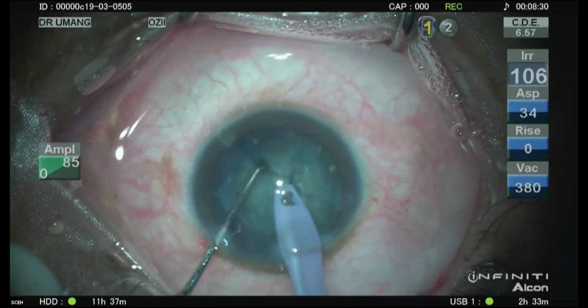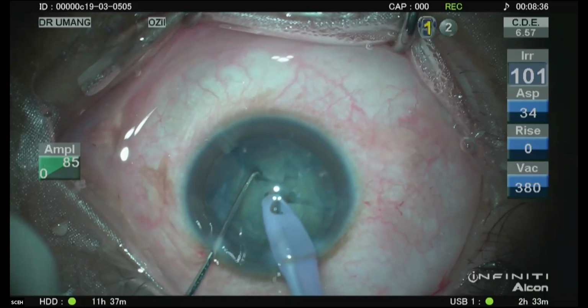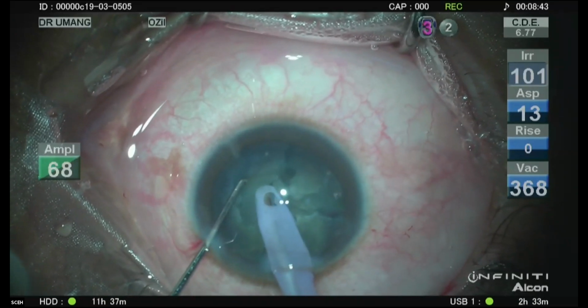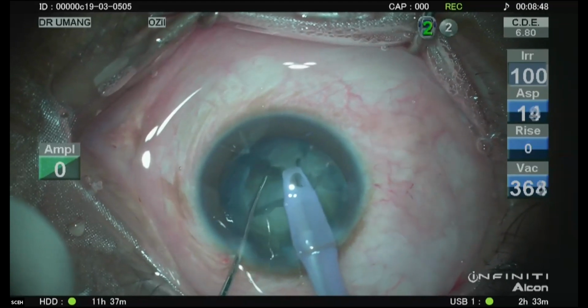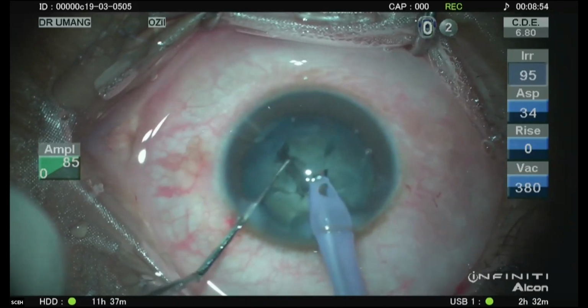By staying pretty much there with my chopper, I'm going down further from the crack where I started the crack. So again, I dip down and I separate and I separate again. Here I go. Now I've got all the cracks.